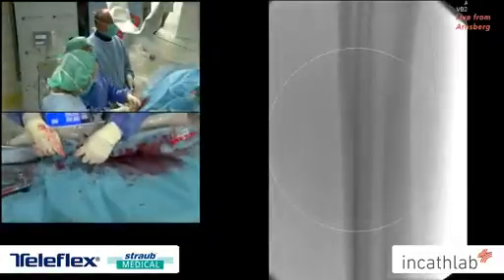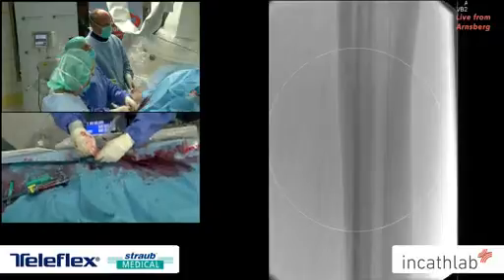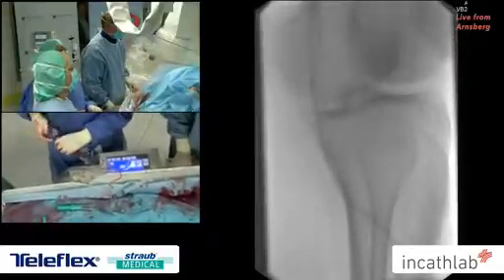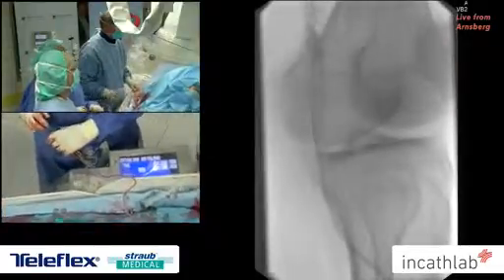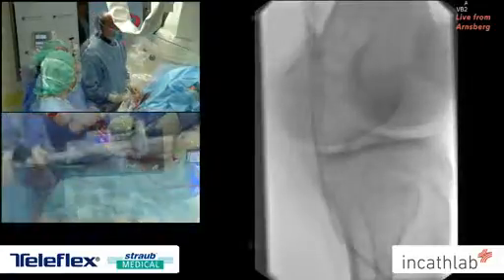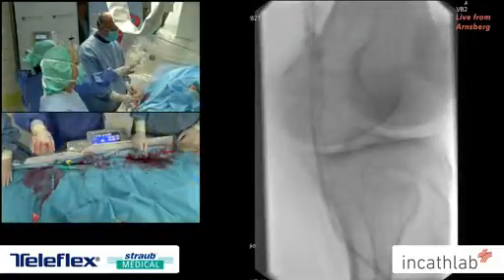In this case, which catheter did you use to follow the guide wire? We used the GPS catheter. GPS, okay. Yes. This is also a very good support catheter. It's even a 3-in-1 catheter. It's also very good for supporting.